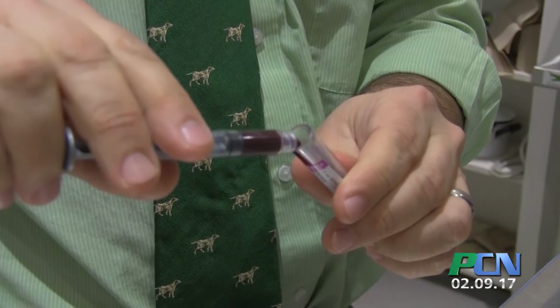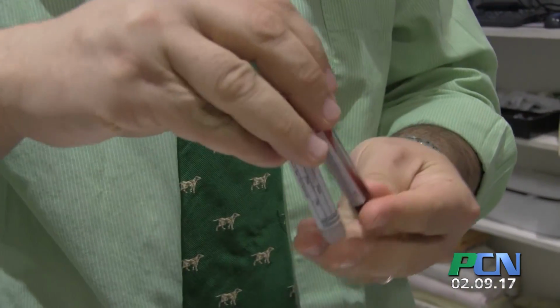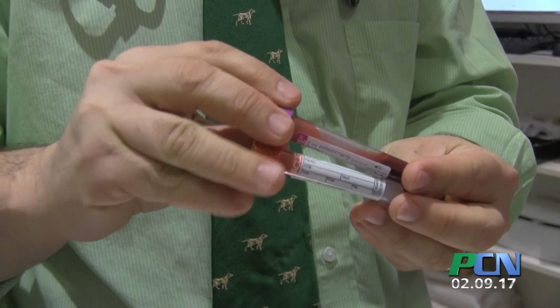And then we're looking at the types of cells that are floating in the blood, their ratios of one to another, and the total numbers of them that are in the blood. They tell us whether the cat maybe has not enough blood in him or whether he's fighting an infection, and sometimes it tells us what type of infection he may be fighting so that we can choose the appropriate drug.